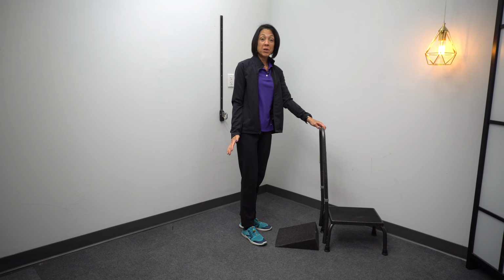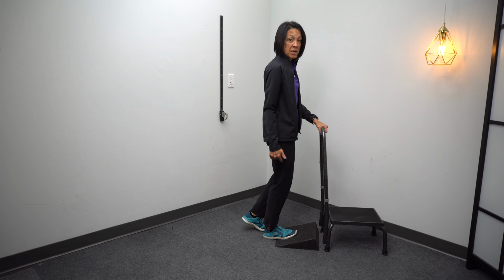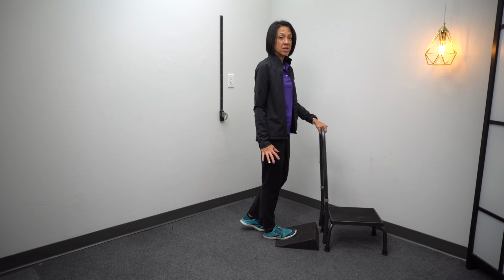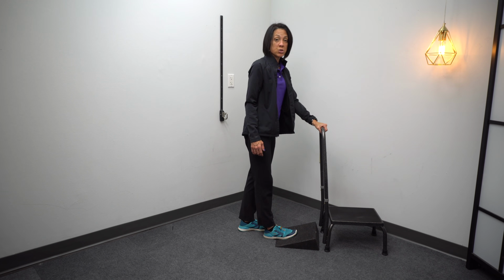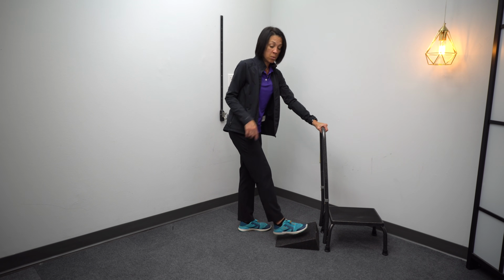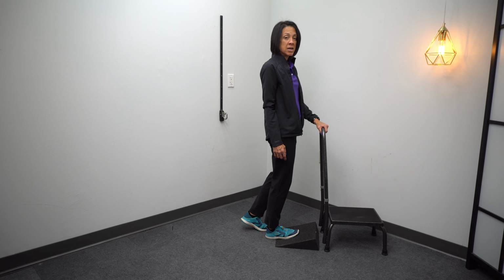All right, so for those of you that have been around for a while, you know that the stretch that I promote the most if you have foot spasticity is just straight dorsiflexion. Remember, I'll repeat it several times for those of you that aren't that familiar with the anatomy: the gastrocnemius is the muscle on the back of the leg. That's usually one of the muscles that's overactive and causes that foot to point. So what we want to do is make sure that we don't allow that muscle to adaptively shorten. The best way to do that is to stand on a wedge.